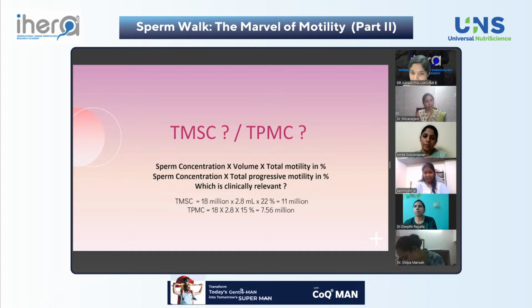One more thing is sperm viability post insemination. Sometimes we see good motile spermatozoa after processing, with 95% motility, but in some patients there is a very fast decrease in motility in the media. If you keep incubating those spermatozoa, after 2-3 hours you'll see a big chunk of pellet being formed from the suspension. So the 24-hour survival test is also a very good indicator for choosing the spermatozoa for IUI.